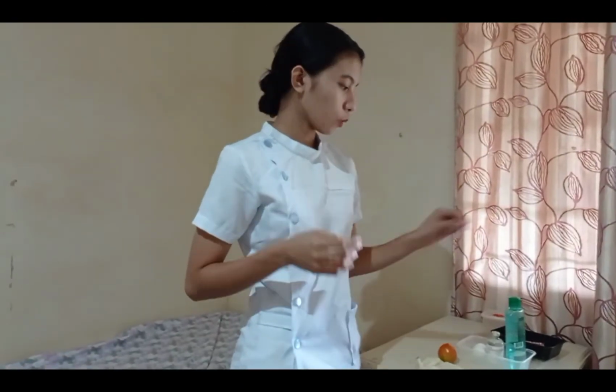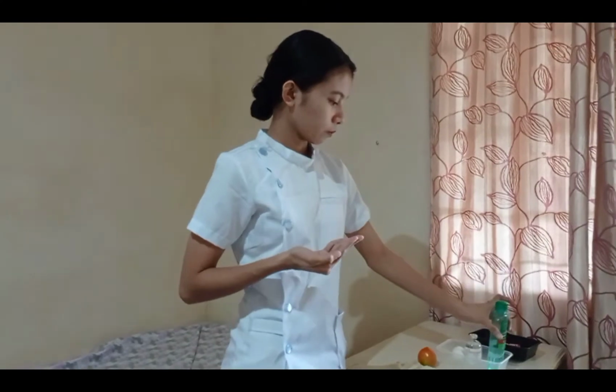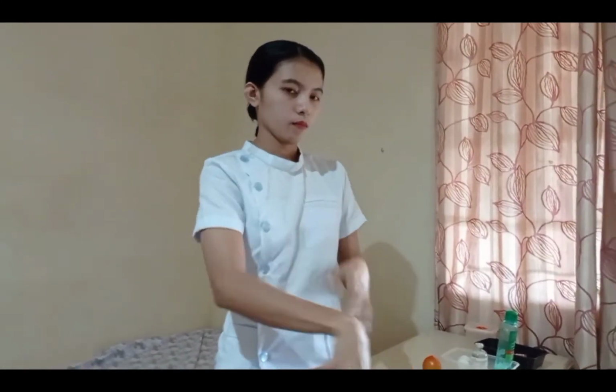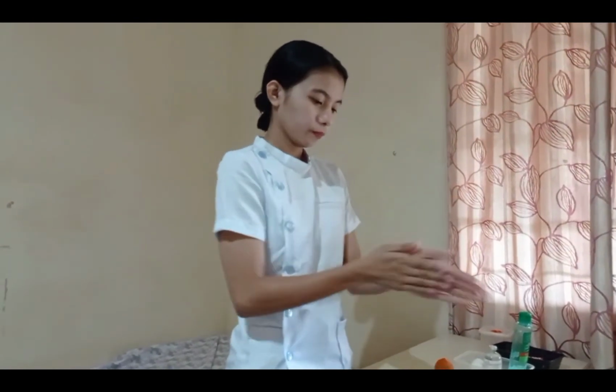After checking, we do hand hygiene again using the ABHR. Then wear gloves, the non-sterile gloves.